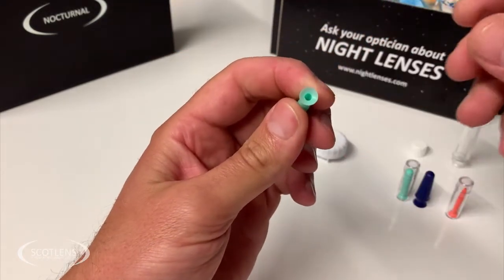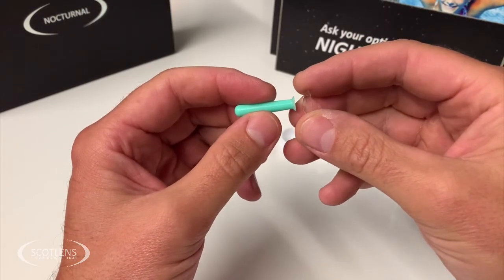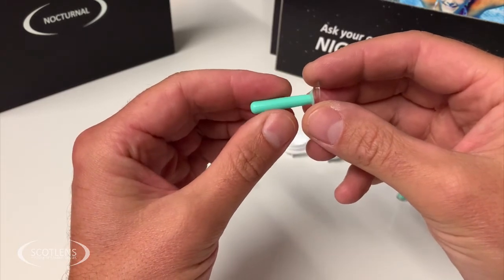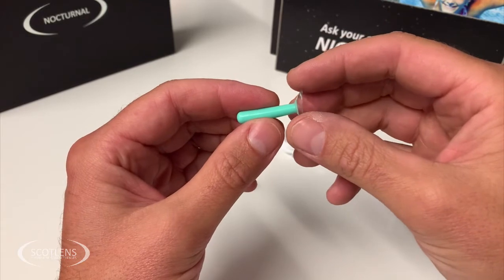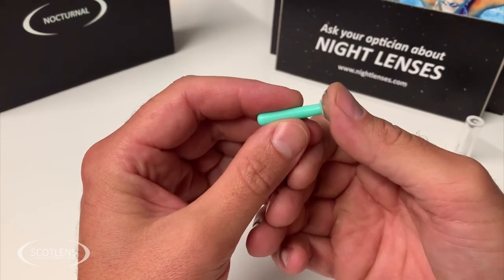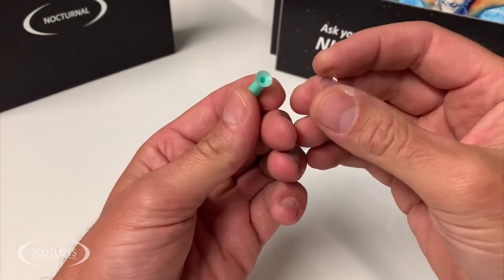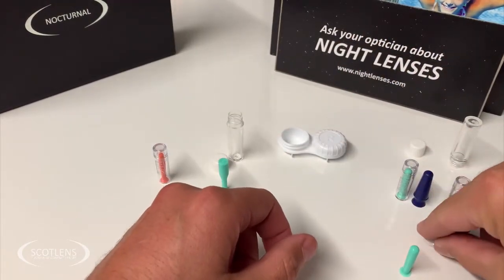Hollow suckers are not ideal for removal because once you've got everything lined up you have to place the sucker, squeeze it, put it on, release the sucker, and then start applying pressure to pull — it's much more complicated and you're much more likely to squeeze the contact lens, which causes the lens to sucker onto the eye. So hollow suckers are for application of lenses, and solid suckers are best used for removal.